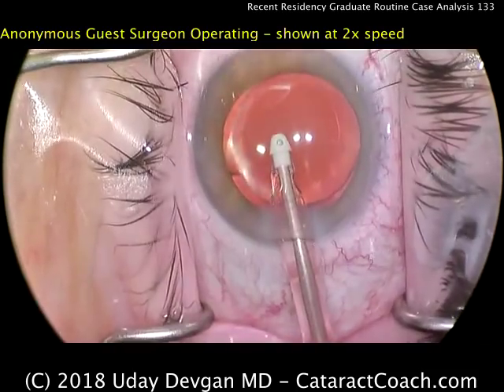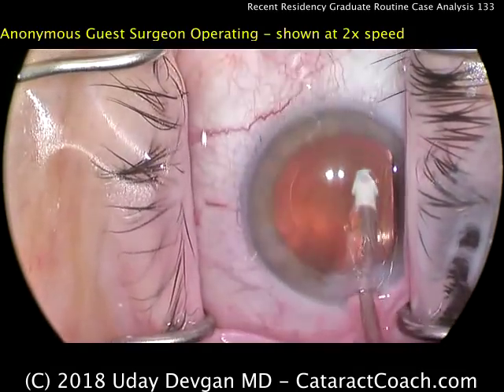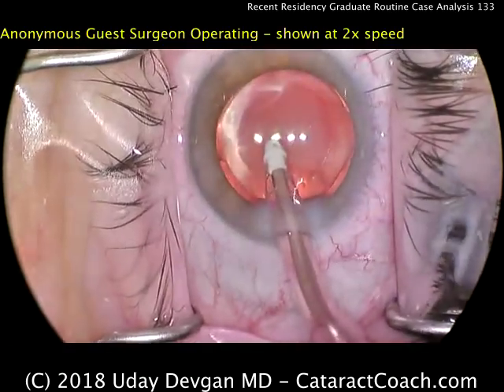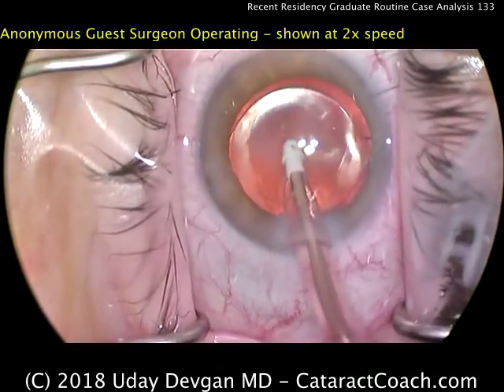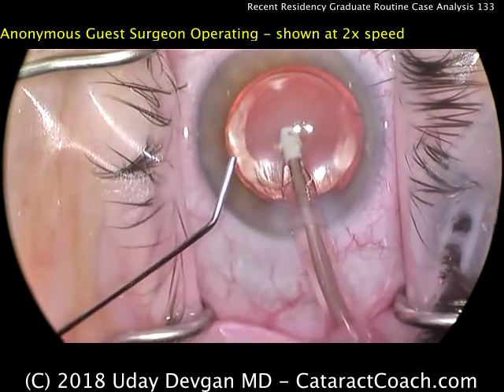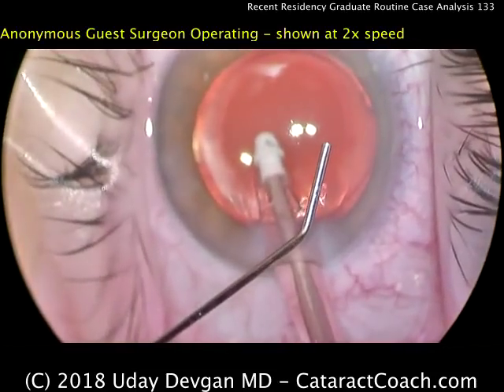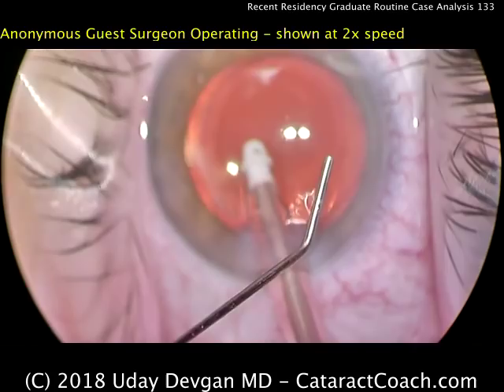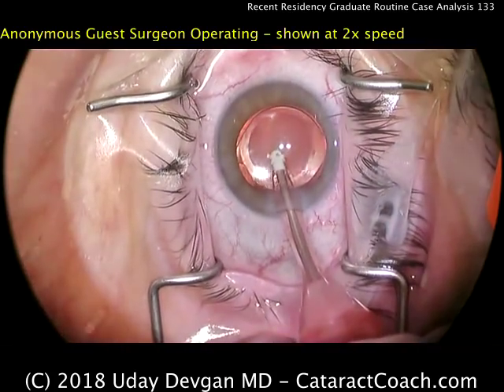Removing all the viscoelastic again. Good overlap of the rhexis — 360 degrees. That's a nice size rhexis, about 5 millimeters, maybe slightly less. Of course the optic is 6 millimeters. Looks beautiful. Eye is in great position. Everything looks good. Not sure what we're zooming in on here, but I'm happy with the outcome.